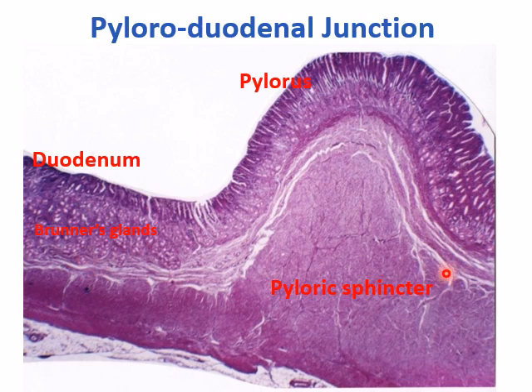A long strip, so it is a junction. A very characteristic thing here, this elevation, this huge hump, is the pyloric sphincter, which is the inner circular layer. Here, near the pylorus, I have pyloric glands with wide, deep pits, and the submucosa contains nothing. Here near the duodenum, I have the Brunner gland, and the muscle is less. The Brunner gland is a mucus gland present in the submucosa.